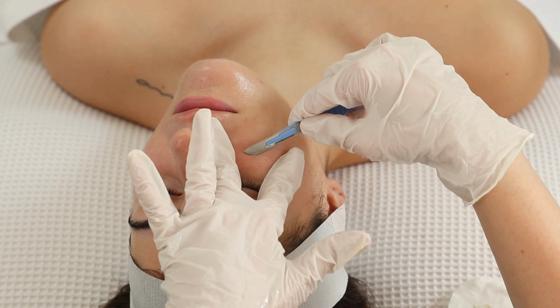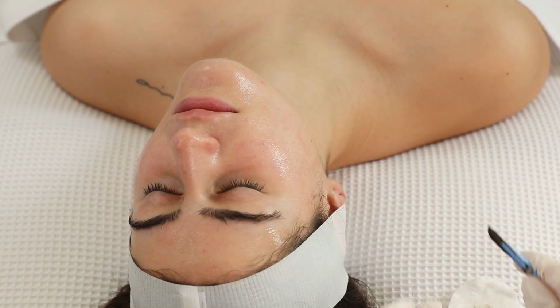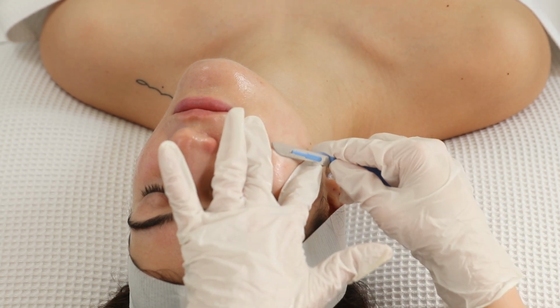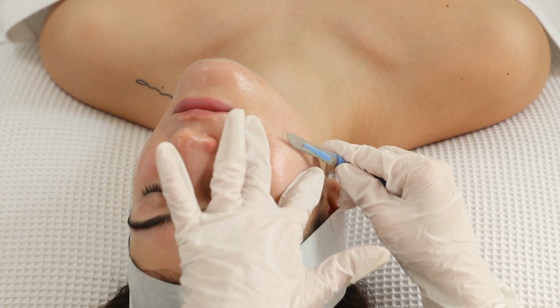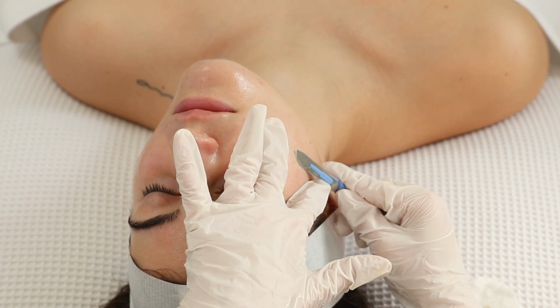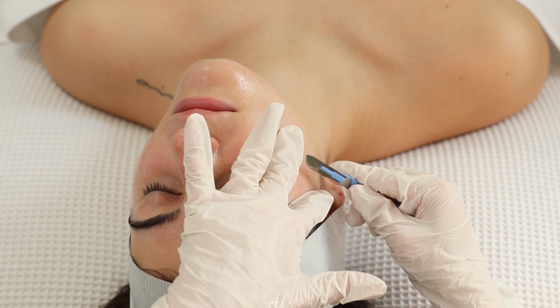Once you have completed one small section, wipe off any residue of the blade and move on to the next section. And as you can see, we're doing very small sections per time. Always make sure to stretch the skin and work each small section at a time. You are going to complete the right cheek first and then move on to the left cheek.